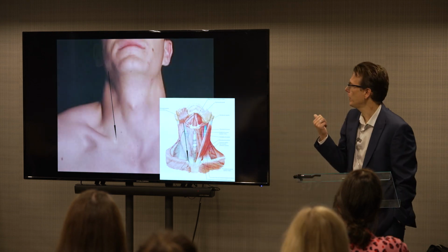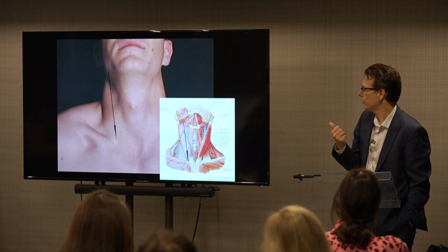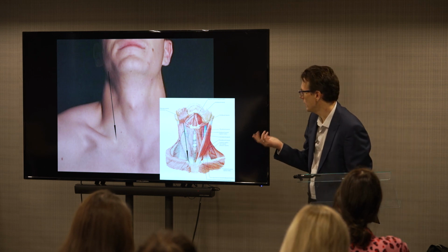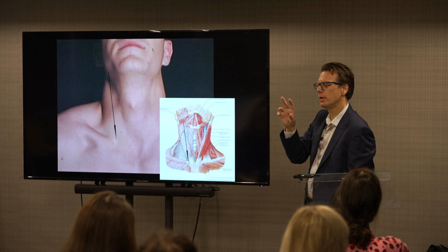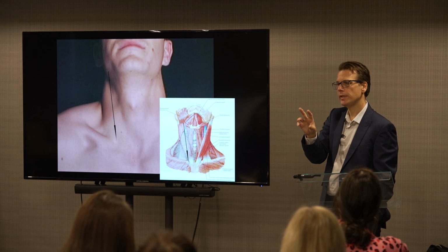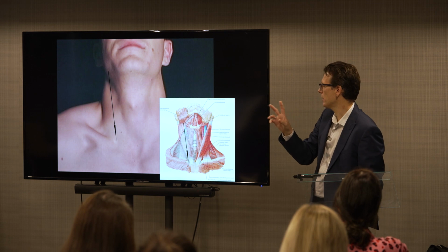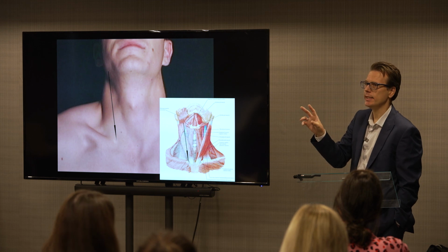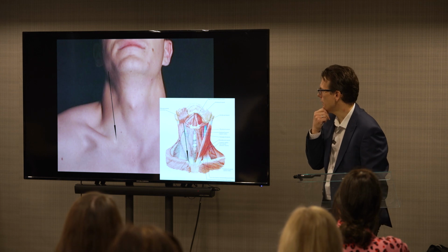So once we've finished with the parotid region, we then want to look along the internal jugular vein through lymph node levels 2 to 4, looking at lymph nodes essentially. And just make sure that when you're doing this, your carotid and your internal jugular vein are in the center of the image. Okay, that it's not off to one side. Often when trainees start doing this, they don't do that. It's kind of off to the side, and they don't always see everything they need to see. So having that in the center helps you with your assessment.